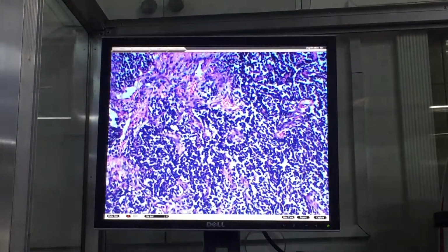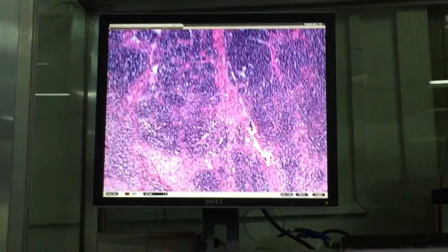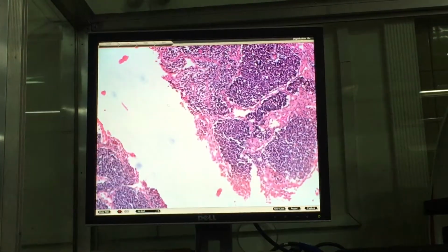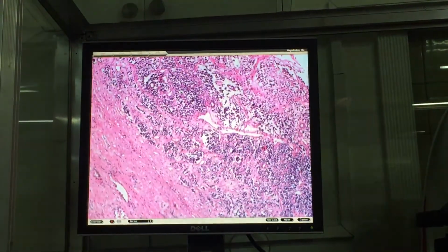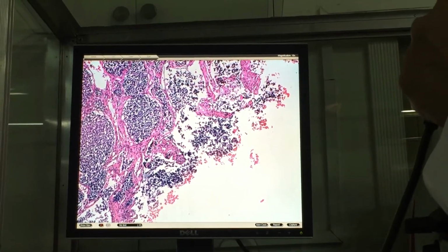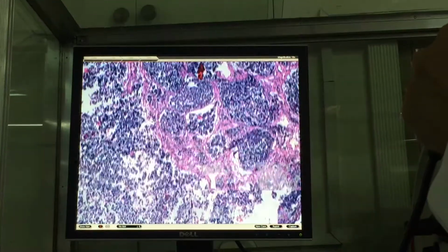Anyway, I think I cannot find yung more typical. This somewhere here. May area dito. Okay, I'll just. Anyway, that's your Wilms tumor. Okay, blastemal cells, fibrous stroma, and the missing epithelial cells.